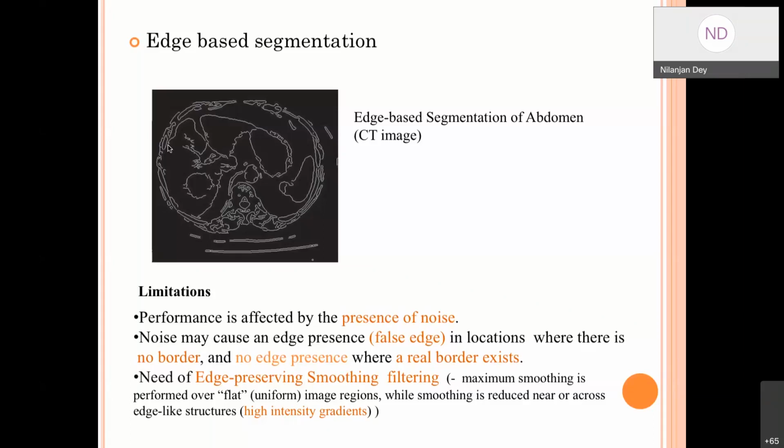There is a high chance that it will go for under segmentation or over segmentation because you are trying to merge or split. So selecting the optimal number of segmented parts is another challenging task. You have to select where to stop so that it will not go under segmentation or over segmentation. If you are working with a brain image and you go for over segmentation, and then start medication, it might happen that the patient will go for paralysis. Such cases are not desirable.